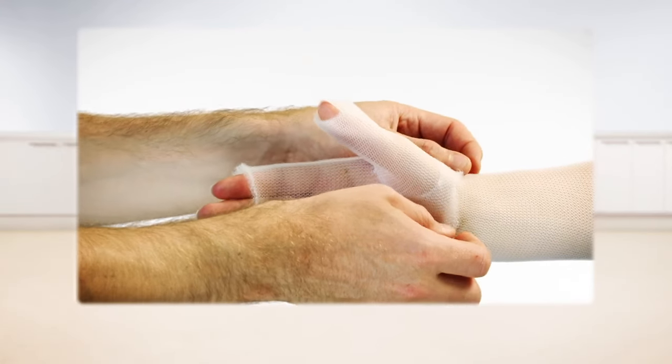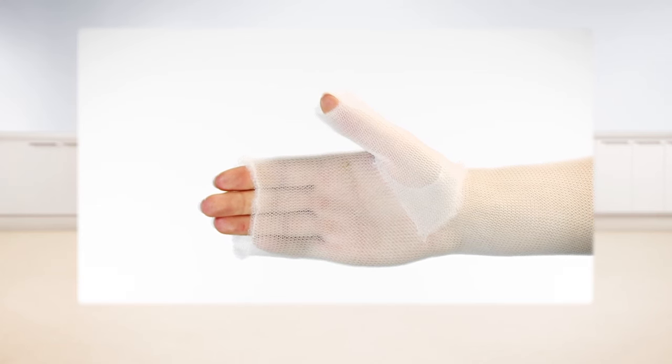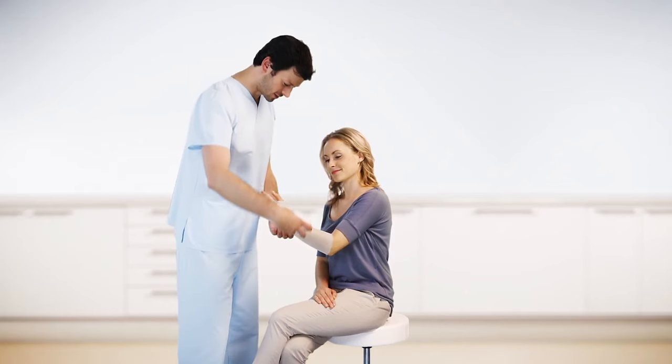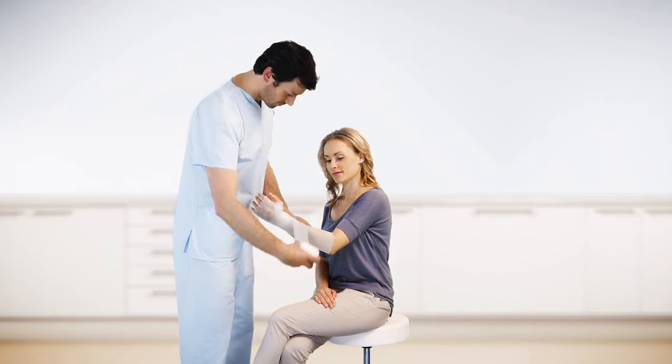Good to know, Delta Dry stockinette and Delta Dry soft liner are also available in a small thumb size. All Delta Dry products are applied easily and wrinkle-free, just like traditional material.